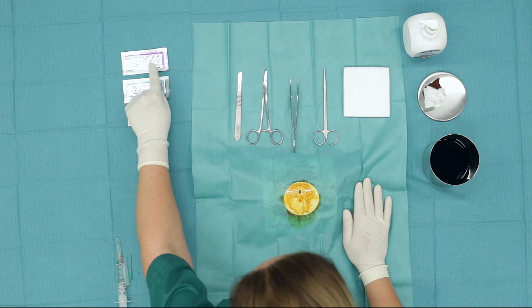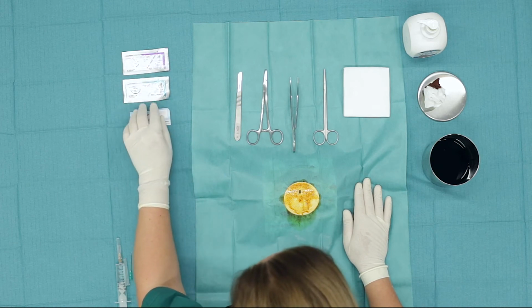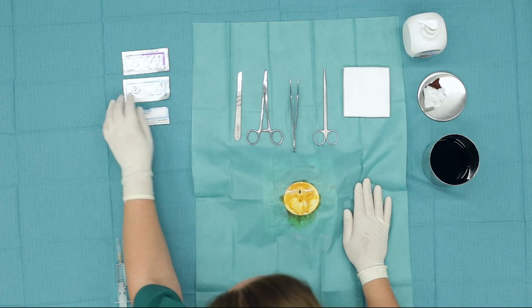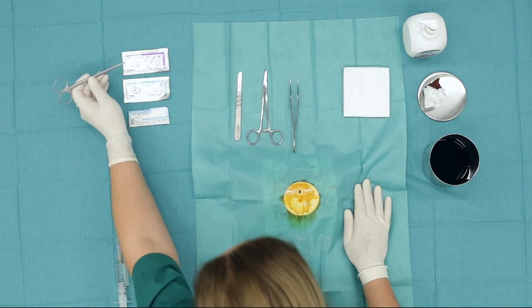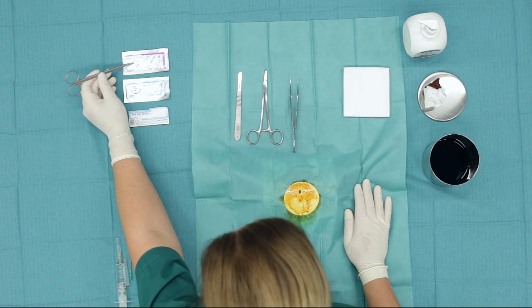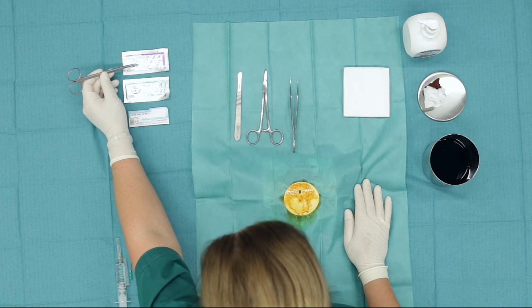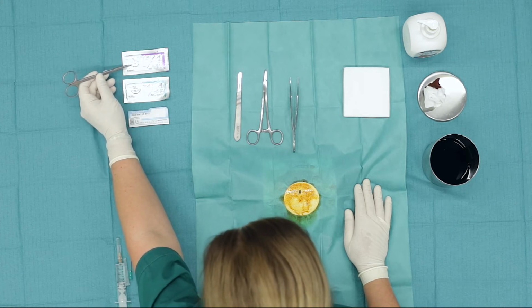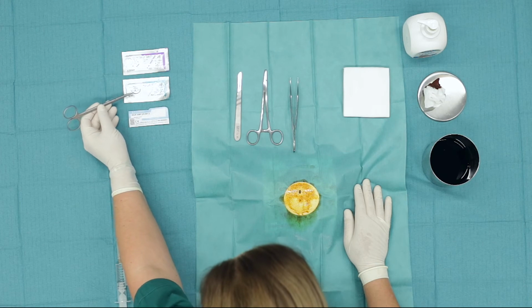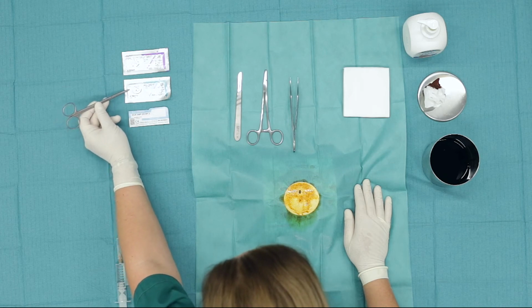The sutures are divided into absorbable sutures and non-absorbable sutures, as indicated on their packaging. These sutures are absorbable and have a triangular needle. This is the other feature of the suture, as well as the curvature of the needle. While these sutures, despite having a round or non-traumatic needle as shown here, are non-absorbable sutures and their material is silk.